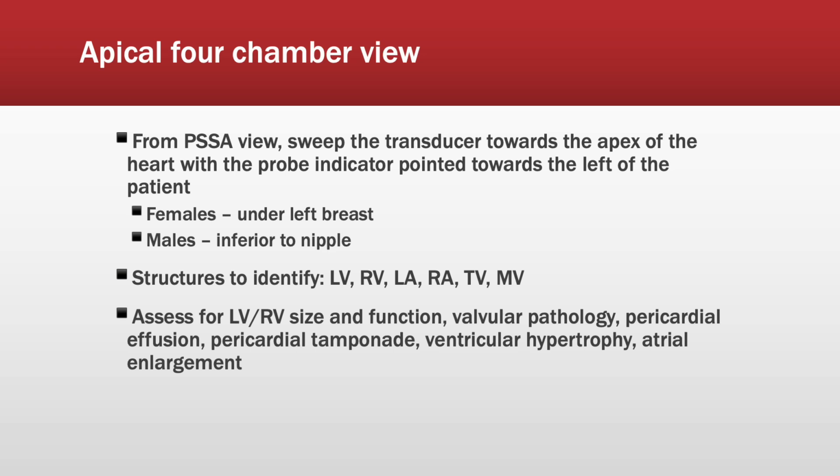Likely, you'll have to optimize the gain and the depth on your screen to visualize the 4 chambers of the heart, as the depth that you were using for your parasternal short is likely not going to be sufficient to catch all 4 chambers.